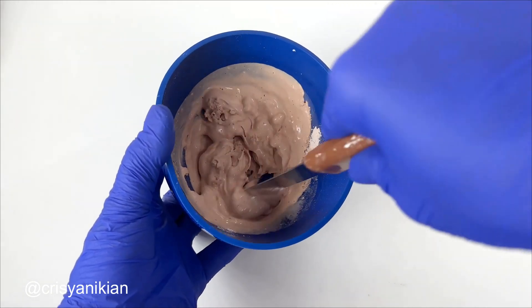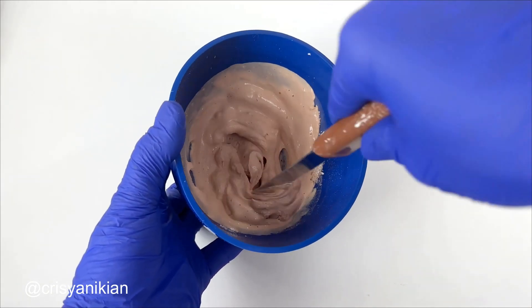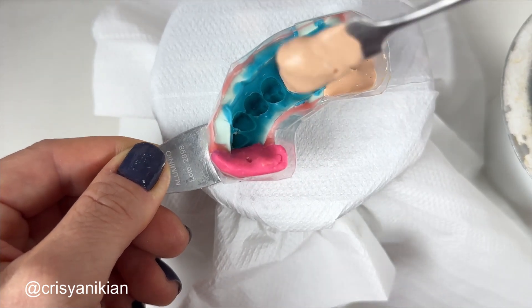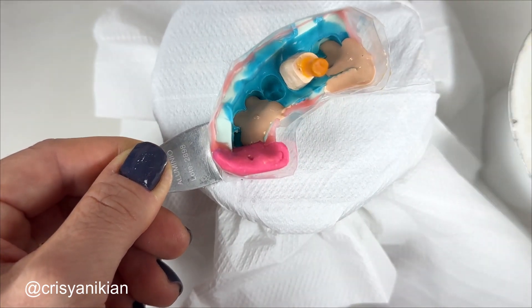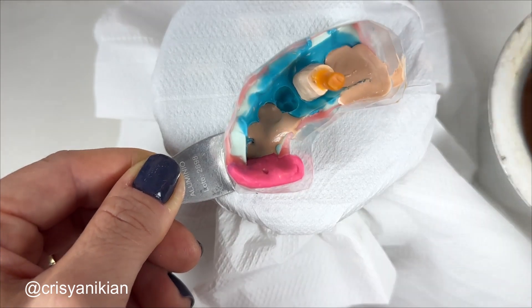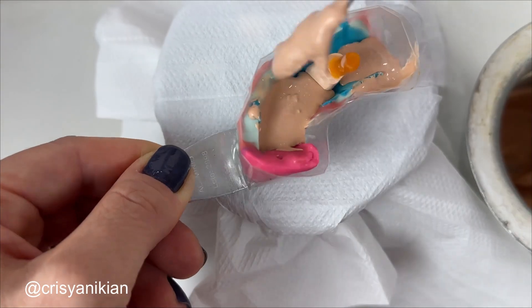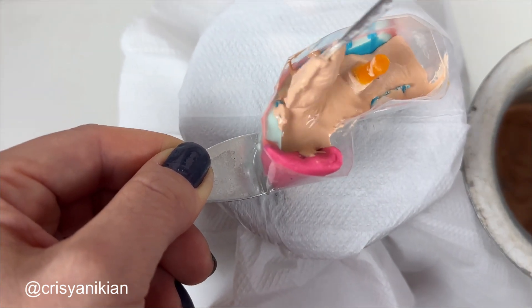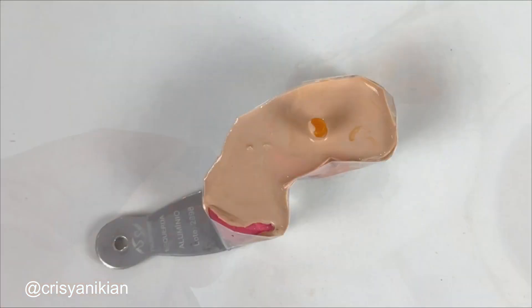Now prepare a larger portion of special plaster — about 40 grams — and pour it slowly using a number 31 wax spatula. Pour the plaster until it fills the entire area of the barrier that you made. Wait for the plaster to crystallize completely.